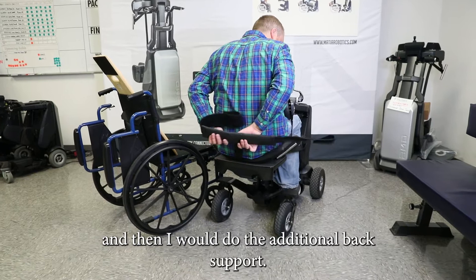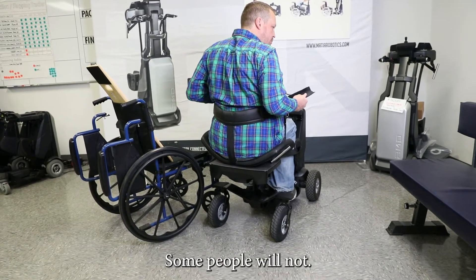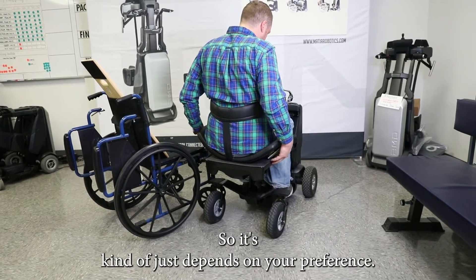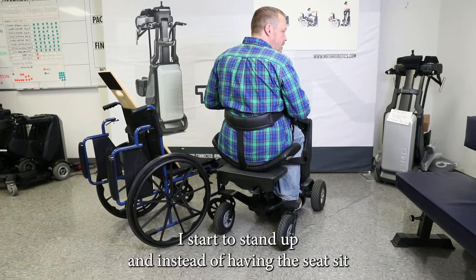Then I'm going to do the additional back support. Some people will use this, some people will not — it kind of just depends on your preference. But once I'm in, my belt straps are nice and tight, and you start to stand up.